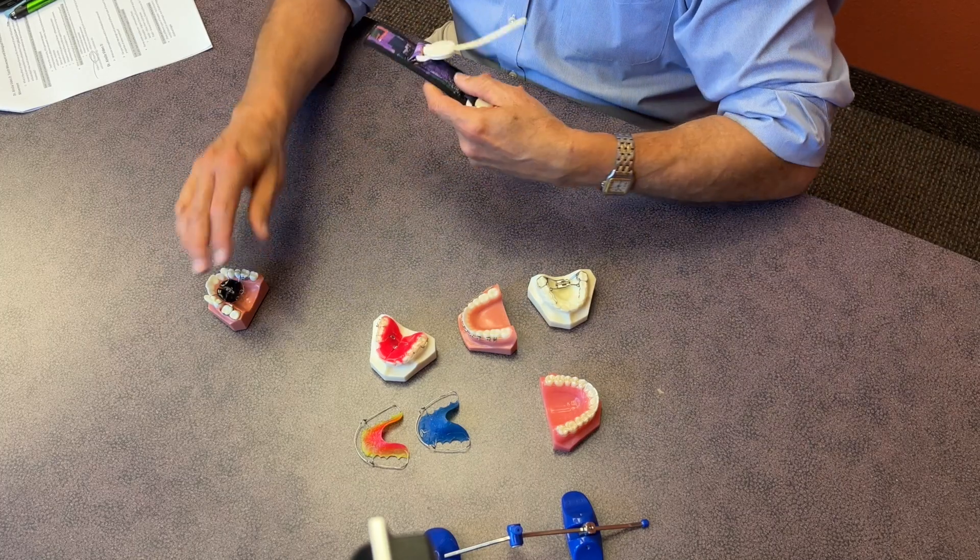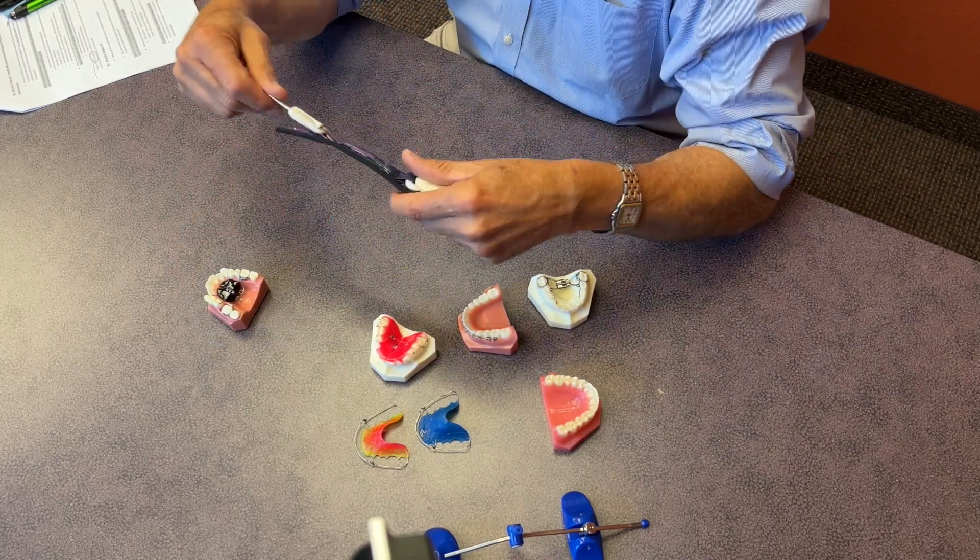An older version of accomplishing molar distalization was headgear, which came around the neck and was worn at night, with a heavy wire on the outside to transmit force to the back molars. What makes a fixed appliance so much more humane is the constant force — it produces some discomfort, but once engaged it's really not uncomfortable. Headgear, while it still works today, creates an uncomfortable cycle where every night you put it on and wake up with new soreness, and that becomes the barrier to continuing.